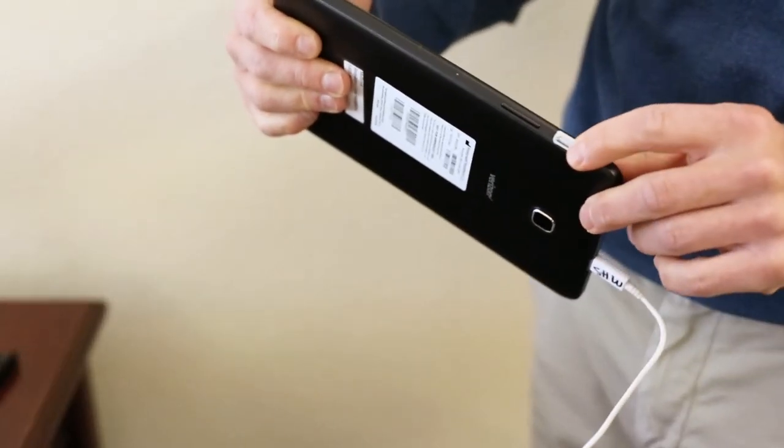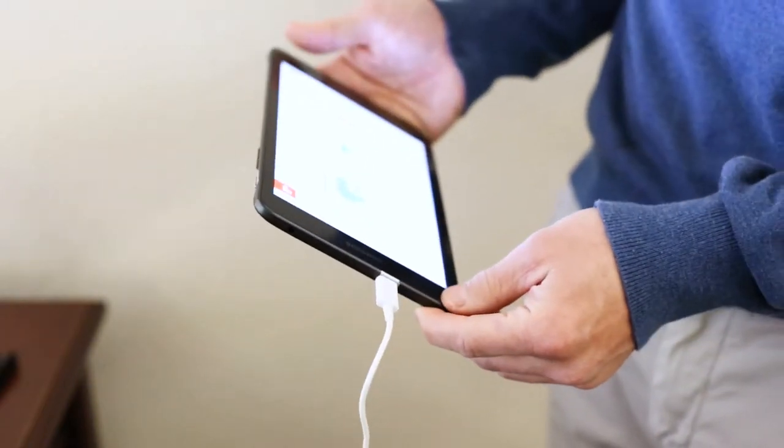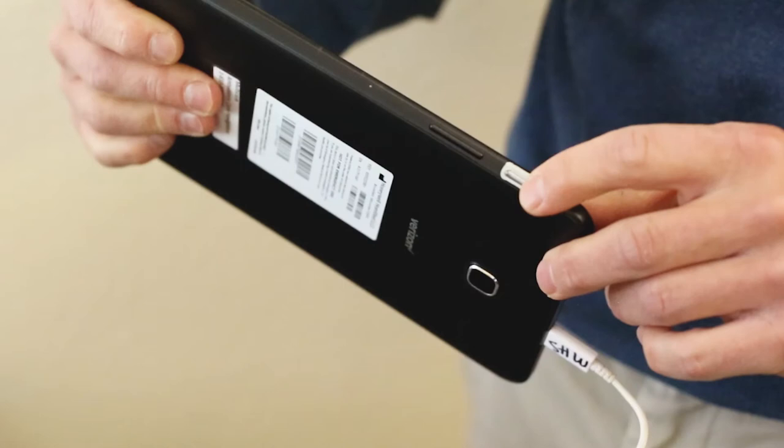There is an on/off button on the long side top of the monitor. There are two buttons located in this area. The smaller button is the on/off button and the larger one controls the volume of the tablet.